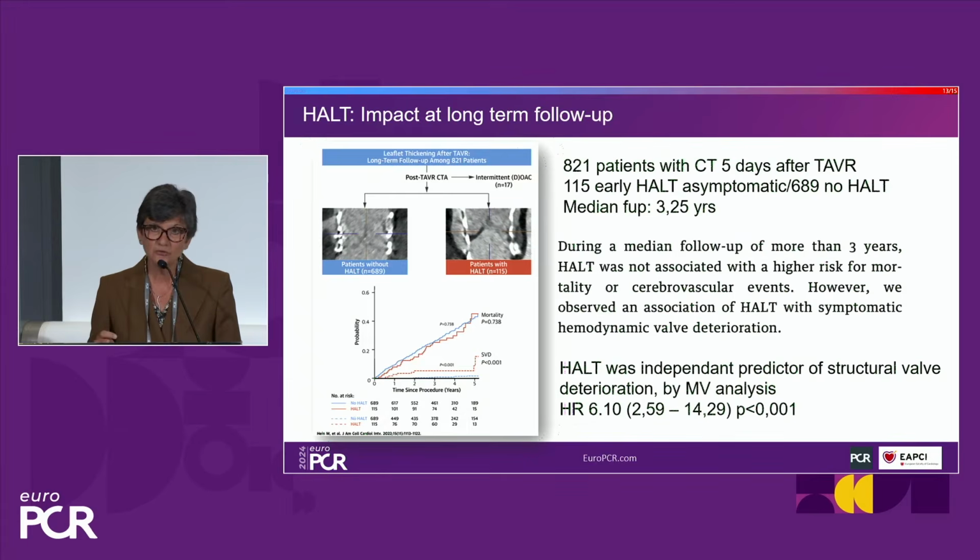So there was no association of asymptomatic HALT detected during routine CT scan early after a successful TAVR with the clinical events in this study, so no relationship with mortality or cerebrovascular events. However, the authors observed an association of HALT with hemodynamic valve deterioration. In this study, HALT was an independent predictor of structural valve deterioration by multivariate analysis with a hazard ratio of 6.